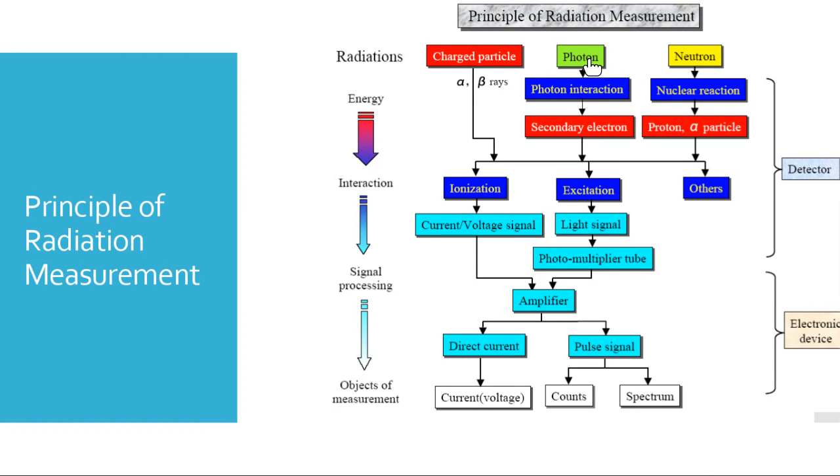Direct detectors are always very efficient in converting the energy from X-rays to an electrical signal. While with scintillator detectors, we change the energy of X-rays to visible light, and then through a photocathode we change this to electrons, and then a photomultiplier tube, as you know, the rest of the story. Scintillators nowadays are not used in many clinical applications, except nuclear medicine, but in CT scan now we mainly use semiconductor detectors because they have efficiency up to 100%.